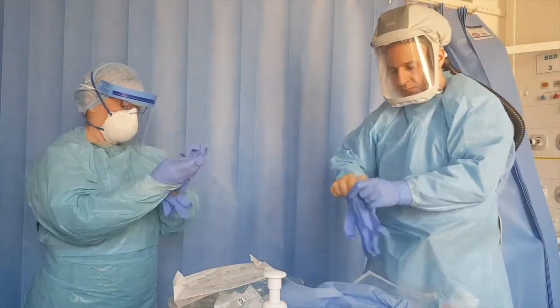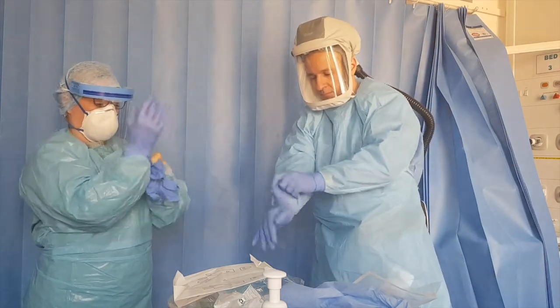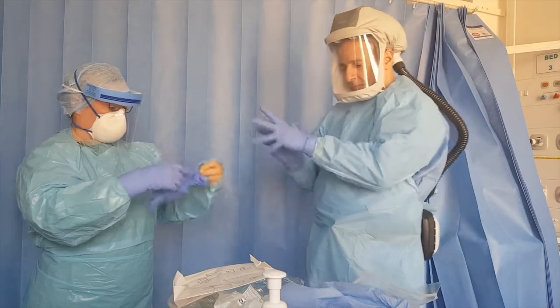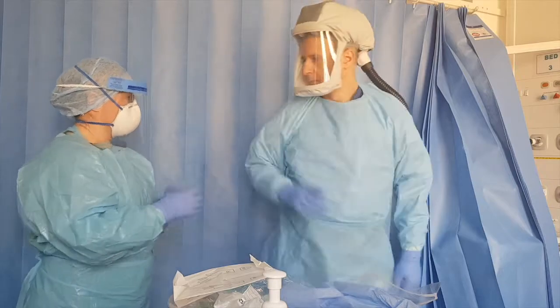This second set allows for doffing of heavily contaminated PPE before transfer to ITU without the need to re-don additional PPE. Use a buddy system to check each other's PPE.